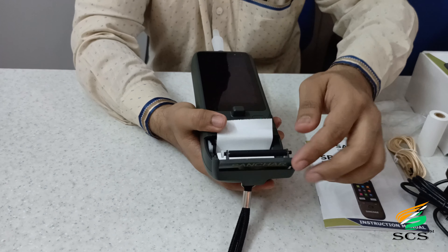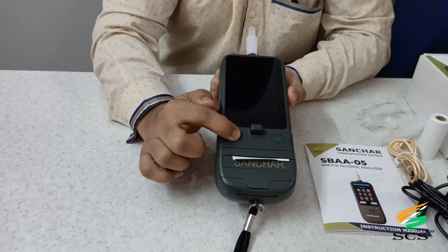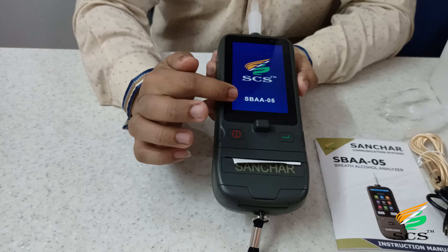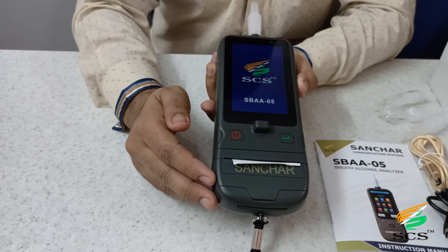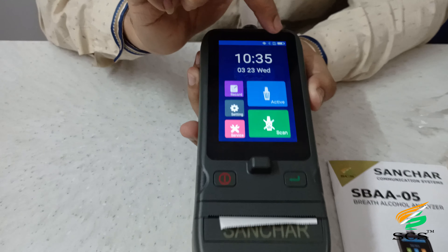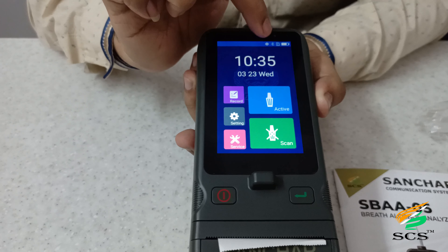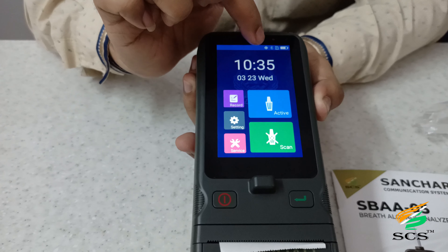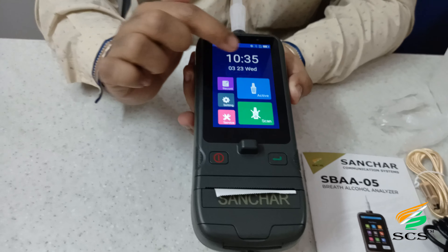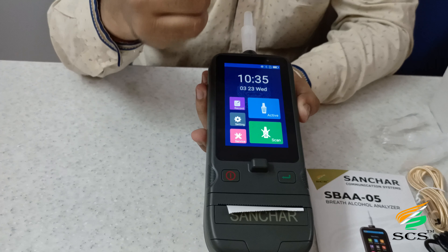This is the attached thermal printer; the user can open the printer like this. The device turns on with a long press of the power button — the logo of Sanchar Communication Systems and the device name appear on startup. This is the calibration details screen. Status icons shown include battery indication, memory card indication, Bluetooth icon, GPS icon, and date and time.